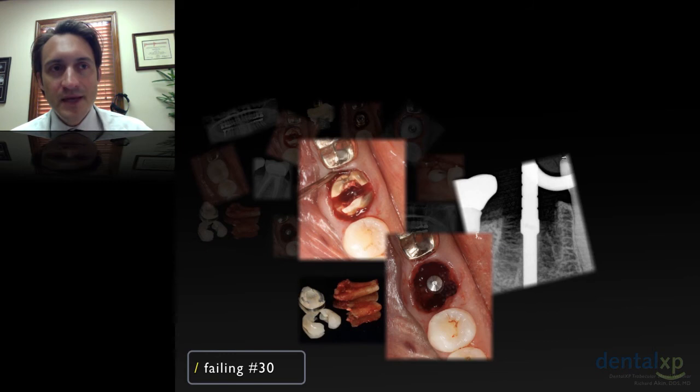You can see the beginning of the implant procedure and the positioning cylinder here. The positioning cylinder is in place in the furcation. The implant needs to be in the center, and I don't place implants in the mesial or distal. I place implants immediately in the center of the tooth. I want this to be optimal restoration position. My philosophy for implant dentistry is, I want to place the implant as if I'm going to restore it. And this is where I'd want it, and this is, if I was a restorative dentist, where I would insist upon it being. And I like it along the central groove.